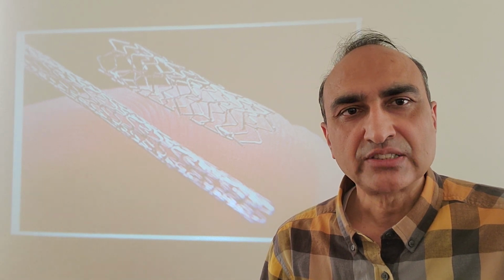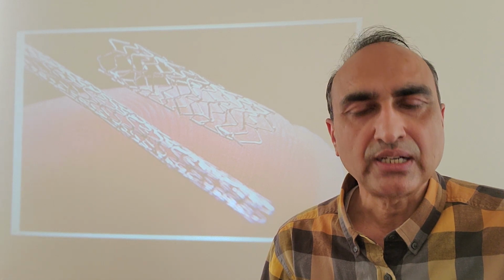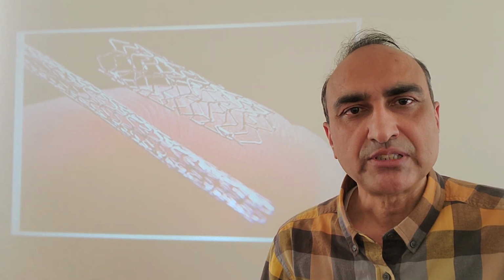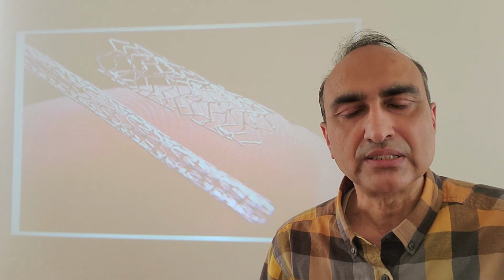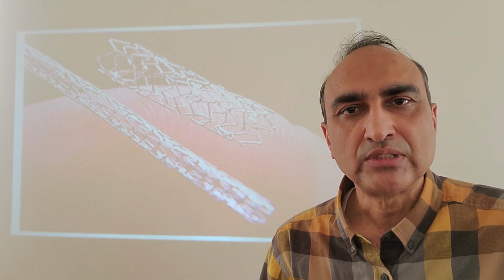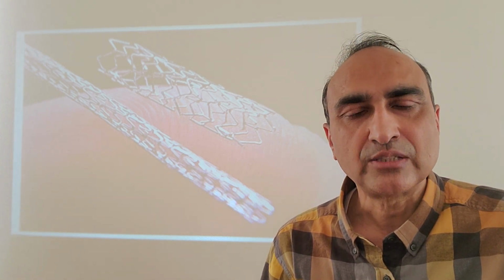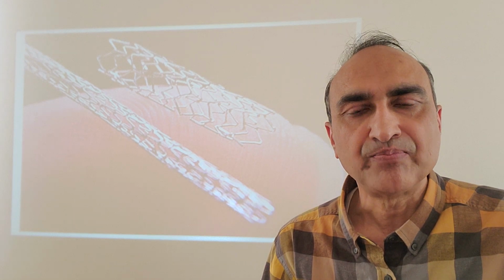Many years ago, when coronary blockages were noticed as a cause of heart attack and people dying, there was an intention to develop a technique where you can go minimally invasive and try to fix those blockages. Almost 20-25 years ago, the majority of the time it was coronary artery bypass surgery, but then as the technique developed, the percutaneous approach, which is coronary angioplasty and stenting, came.